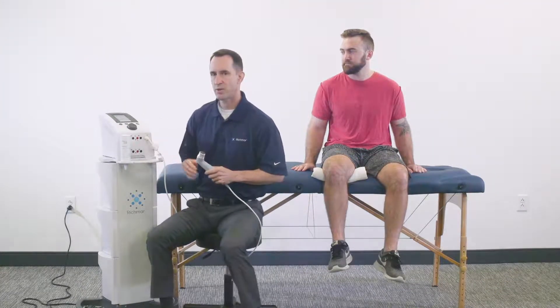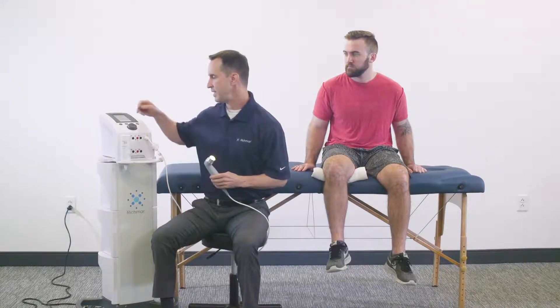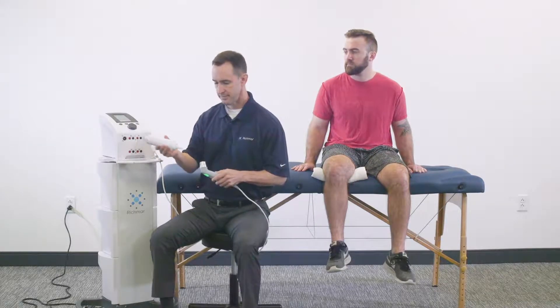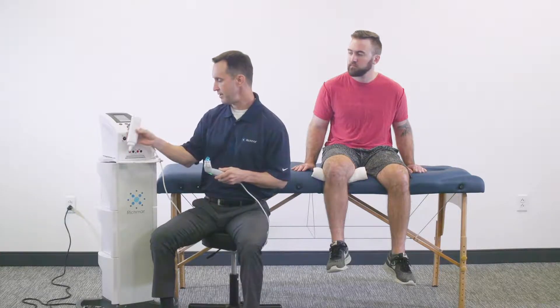Now I'm going to go over to the CX-4 combo unit. We already have the protocol up on the screen. I'm simply going to touch the amplitude — the watts per centimeter squared — and increase the intensity with the dial up to one watt per centimeter squared. Then I'll apply the gel to the applicator sound head.